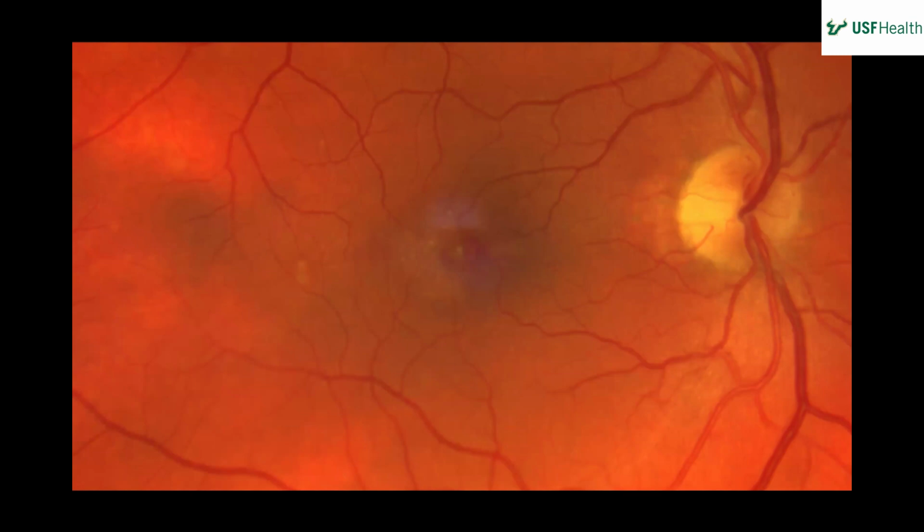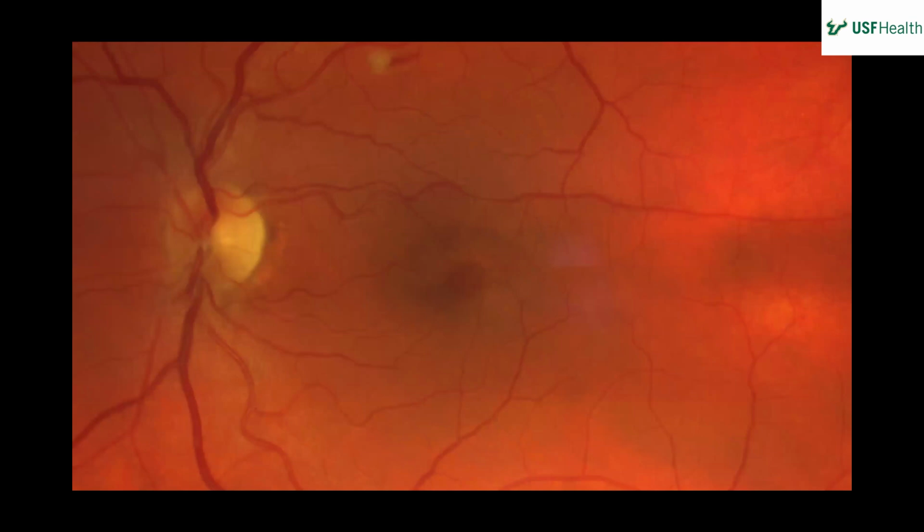Great. Now I'll give you the other eye, and then there's a more detailed photo coming. So this is the color fundus photo of the left eye. Again, looks largely similar. The vitreous appears clear, nerves appear good. Maybe slightly more tortuosity to the vessels, but appears within normal limits. And then I think less so around the macular region. There's some lighter spots around the fovea.